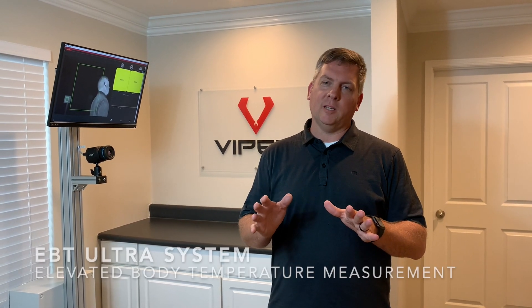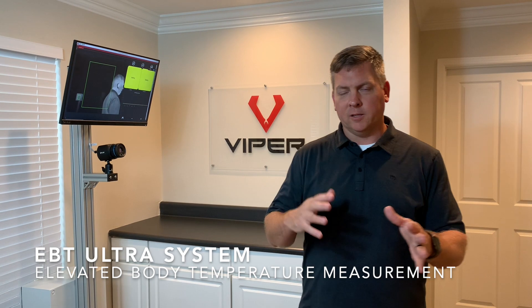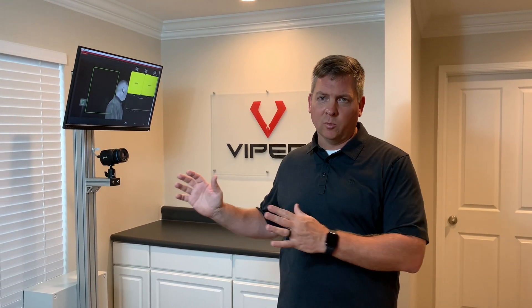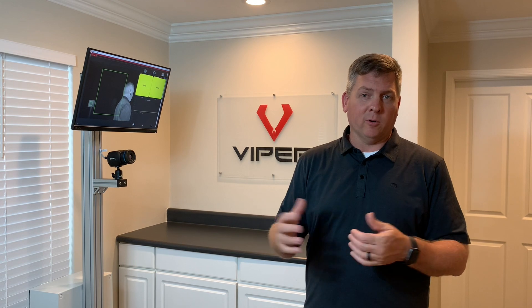Hi, I'm Andy Beck with Viper Imaging. We're going to show you some features of our EBT Ultra system today. This is used for elevated body temperature measurement for pre-screening in these times of the coronavirus and other things that are going on. You can use this device to run multiple people through to see if their body temperature is elevated, one of the indications of a possible fever or infection.